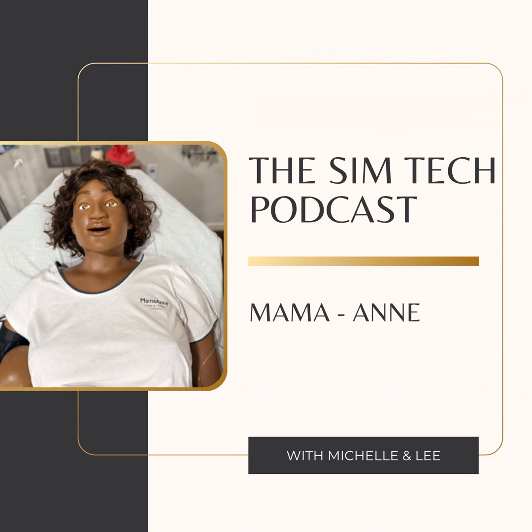In sounds, she has heart murmurs and lots of different lung sounds and bowel sounds as well. I'll just put it on the picture there for those of you watching the video. If you've seen Leap software before, on a SimMan for example, then it's quite similar. You've got an array of sounds that you can put on, and you can talk through your headset and be the patient, or you can upload your own vocal sounds.